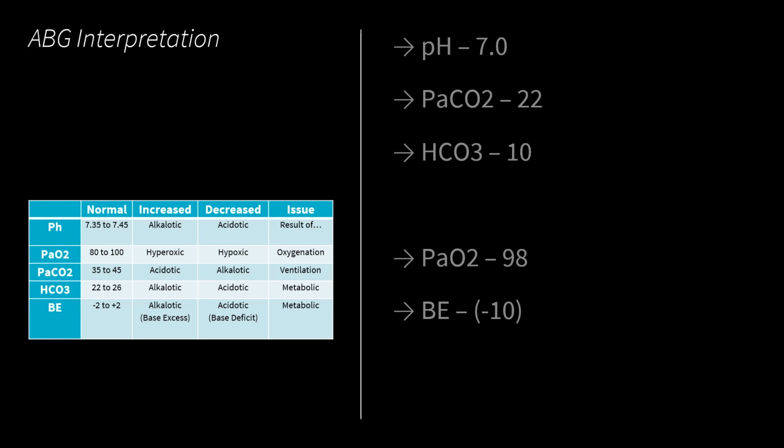So in this case, we've now decided that we have an acidosis and we figured out our cause, which is that it is a metabolic acidosis, meaning something in our metabolic system is producing an acid. And in this case, it's actually kind of neutralizing a lot of the bicarbonate in the system. And then the last part, when we're looking at the acid base with an ABG, is to determine if there's any compensatory mechanisms at play.